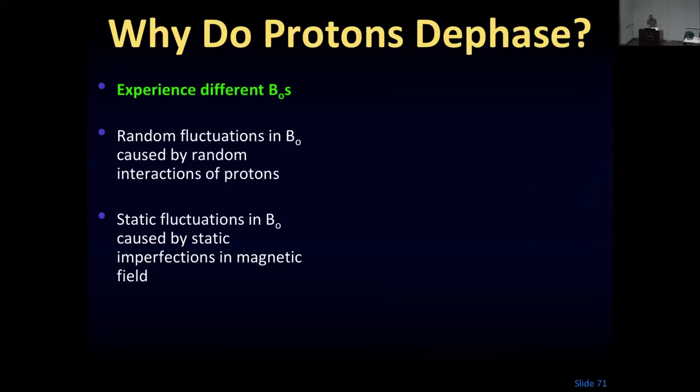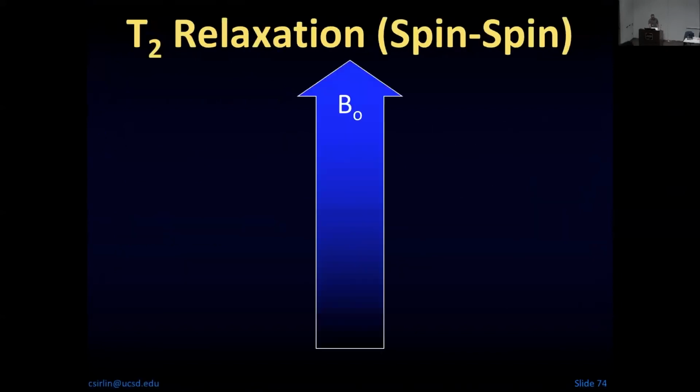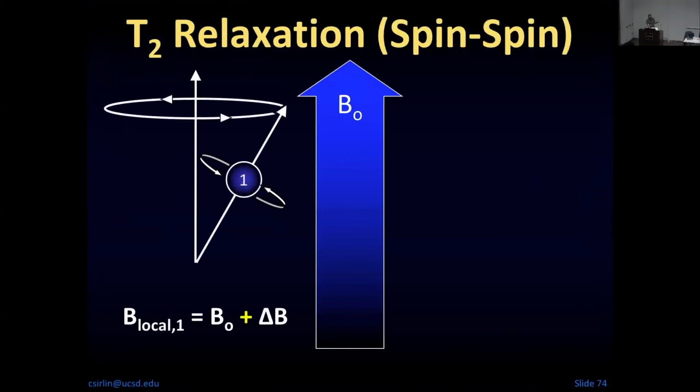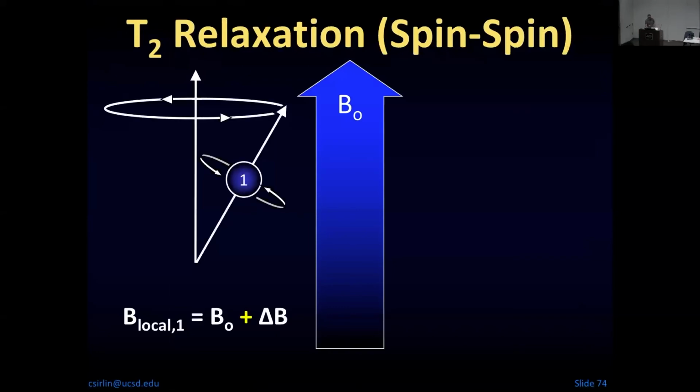So let's go back to Joseph Larmor, and we remember that protons precess at the Larmor frequency. Let's skip this in the interest of time, and let me now explain what I'm talking about. So we start out with an external magnetic field, and now we have a proton. Here we have this $3 million beautiful homogeneous magnetic field. This magnetic field is so homogeneous. But now let's put a proton in there. This proton has a magnetic dipole moment, and this particular magnetic dipole moment is pointing up.